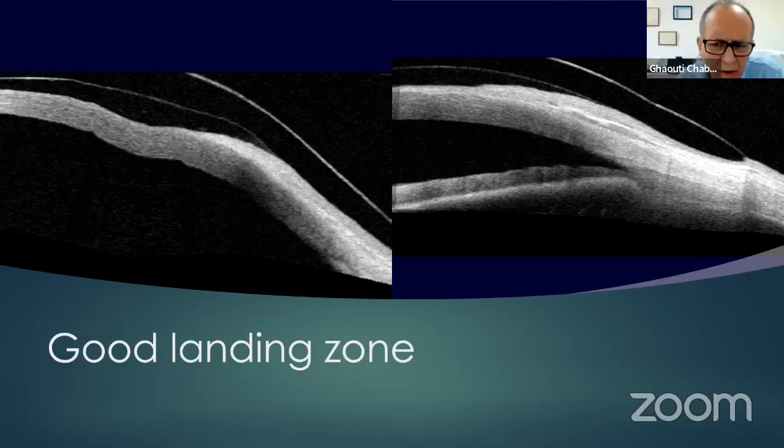Okay, another question before I try to get some questions from the audience. I have seen most of your slides are, I think, full scleral lenses, 16.5 or larger than that. Do you work with semi-sclerals or not? You know, I don't use the word semi-scleral. It's either a scleral or it's not scleral. It's either a woman is pregnant or she's not pregnant.